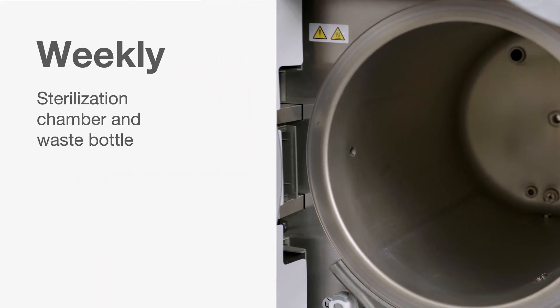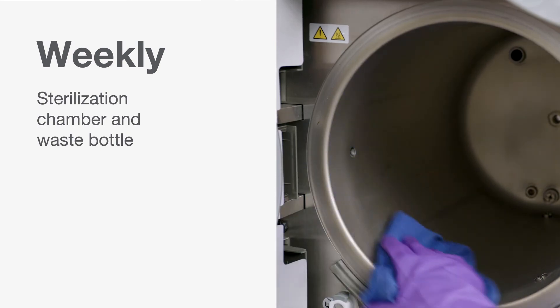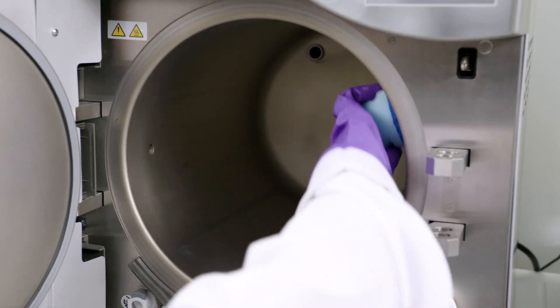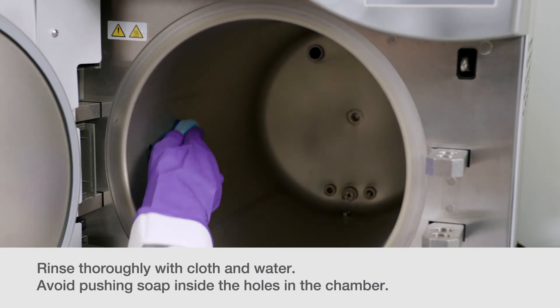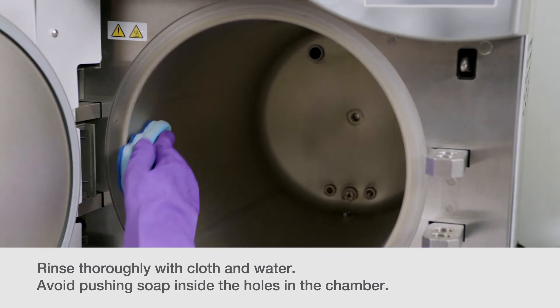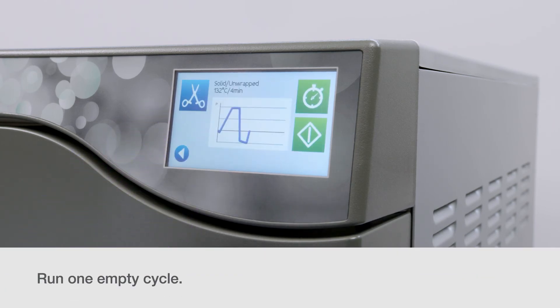Every week, clean the sterilization chamber and, if applicable, the waste bottle. Some cleaners may be too harsh on the internal copper and brass components of the units. Rinse thoroughly with a cloth and water. Avoid pushing any soap inside the holes in the chamber. Run one empty cycle after using any cleaner or soap.